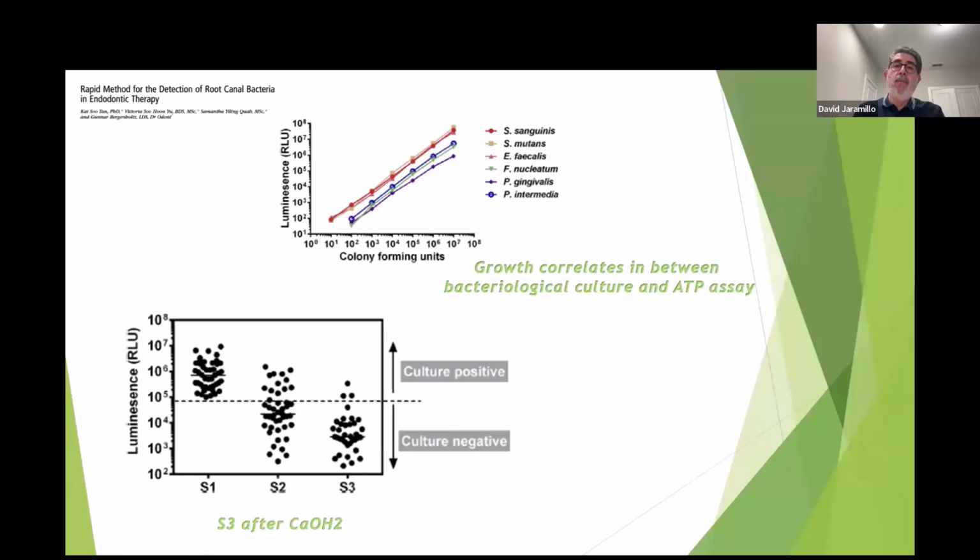Again, if we have done, for example, an upper or lower molar, I have cleaned and shaped MB, DB, and palatal without instrumenting MB2. I take my sample, and it gives me a reading of 100. Then after I instrumented, it gives me a reading of 35, 40. And then when I instrument MB2, the reading goes down to 5, 4, 3, 6, whatever it is.